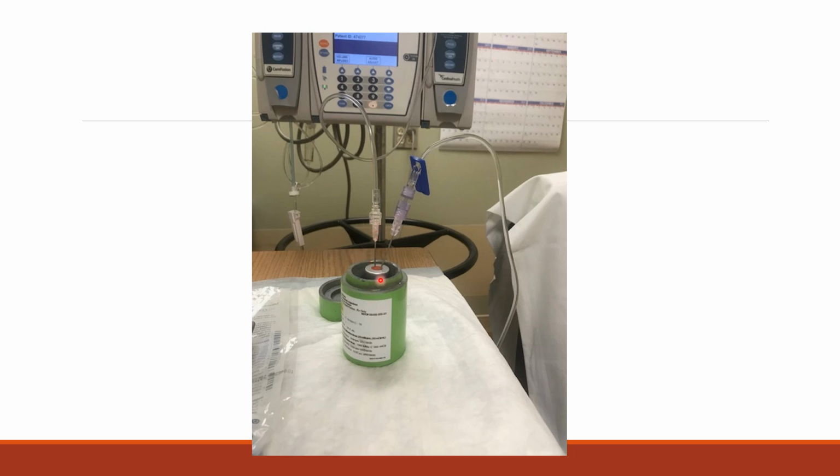the short needle will go into it, and now you don't have that displacement gravity thing going on. Now you just have a mix of saline and Lutathera, and you might as well just pull it out and inject it into the patient because that's not working. So that's how that works. And then once it's done in the vial and the Lutathera is gone, then you can up the saline, and then it just kind of flushes everything out.